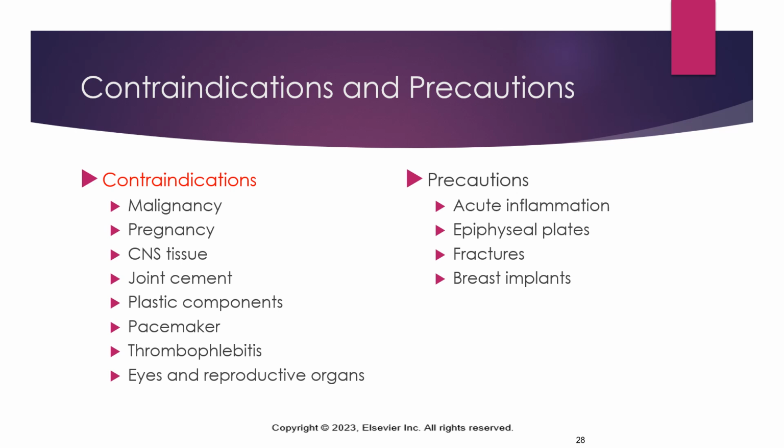So typically I would stay away from ultrasound for younger patients, especially if you're at the end of those long bones. If you have fractures, this is typically something that we're going to stay away from with ultrasound. Even though there are parameters to help induce bone healing, it's something that we're not going to be performing in our lab setting. So if you're curious about that, you can always come ask me more questions. You can do a little research on your own. But there are certain instances where you would use ultrasound to help stimulate bone healing.